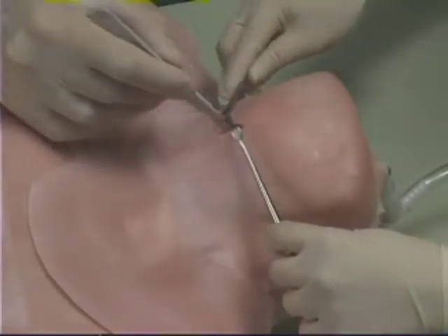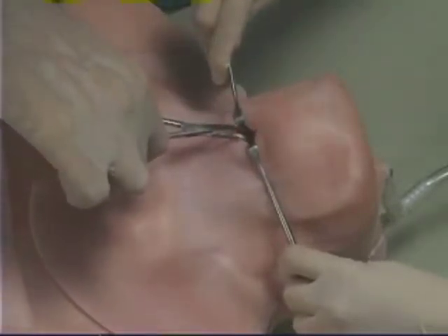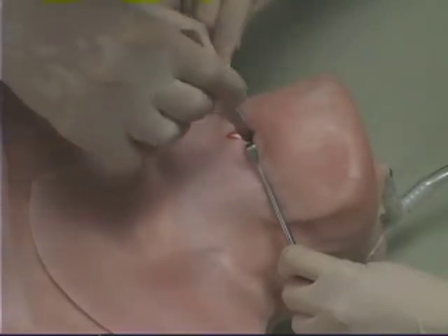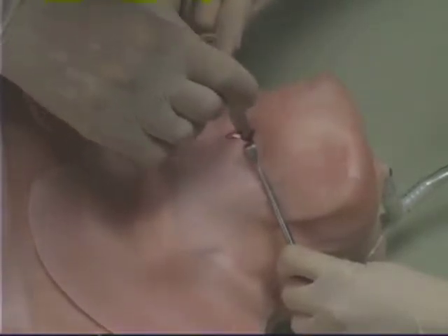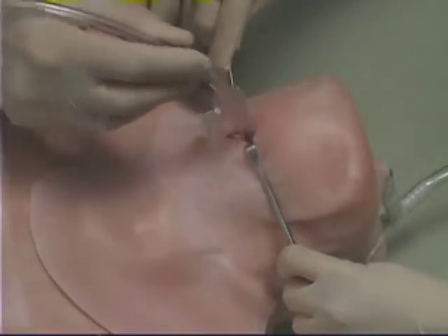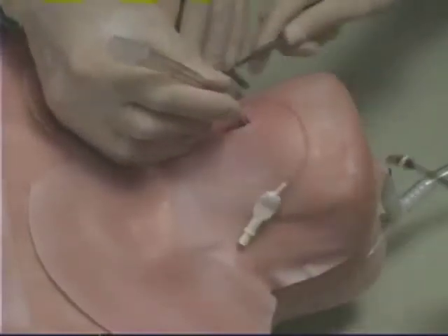For increased realism, a drop of red concentrate can be placed on the lubricated cricothyroid membrane before the procedure. This will provide a minimal blood effect when the student surgically dissects the tissue layers. Once the procedure is completed, there should be breathing through the tracheostomy tube, and liquid may be heard or seen gurgling in the tube.